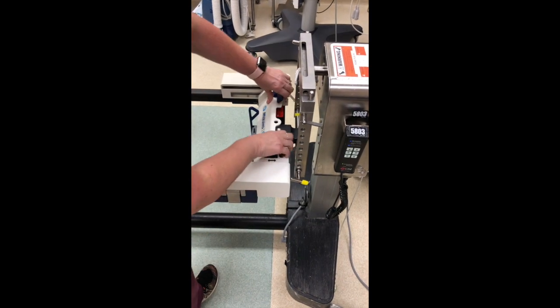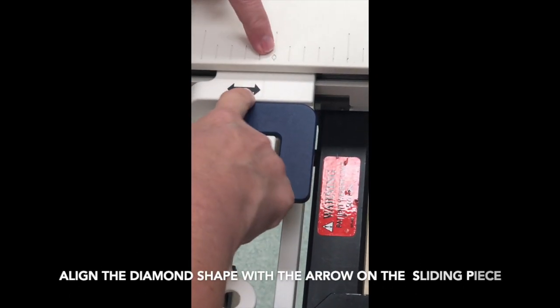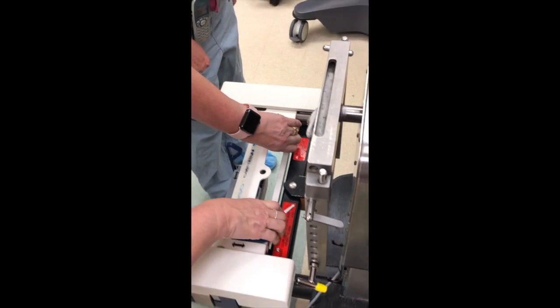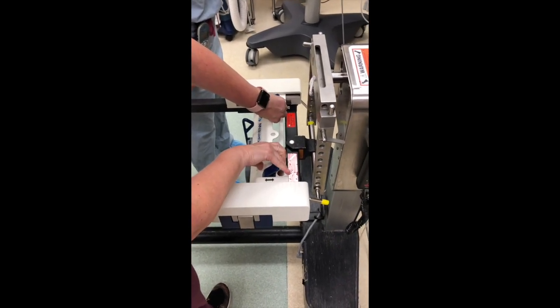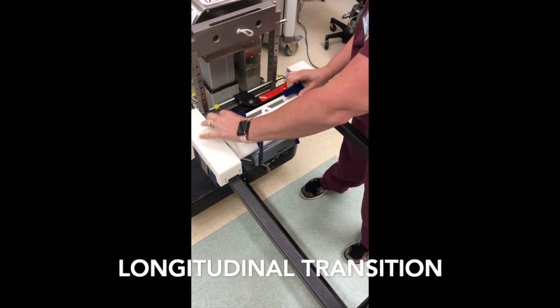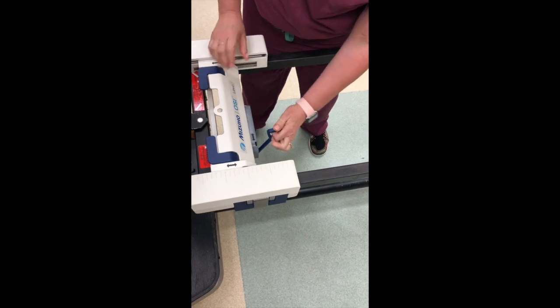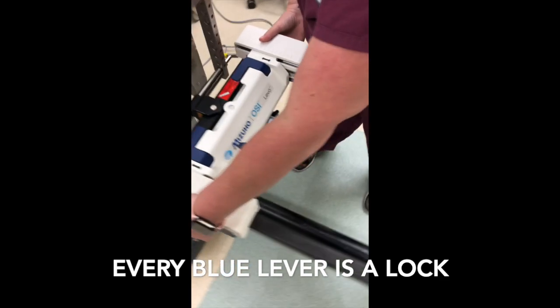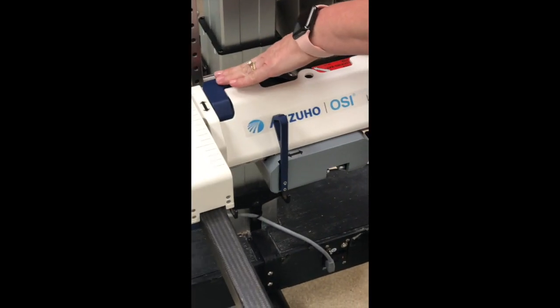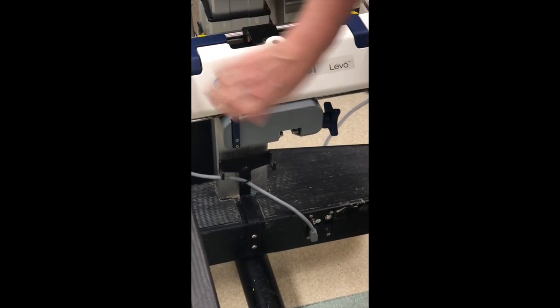Lift the blue handles and align the notch on the bar above the arrow with the diamond on the base unit. That should be the position the base unit is placed in prior to moving the patient over. To summarize: you have the longitudinal transition and the lateral transition. Every blue lever is a lock. This base unit has a double lock, but one of the locks is blue. The longitudinal transition locks when you push the blue levers down, and the lateral transition locks when you push the blue handle up.